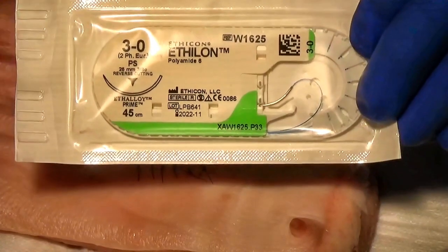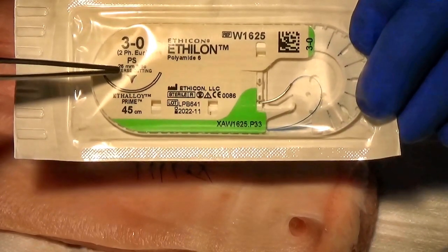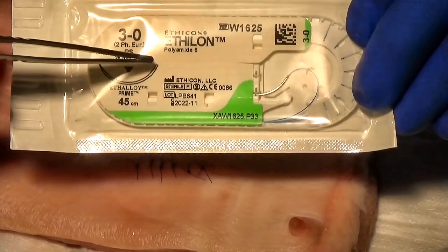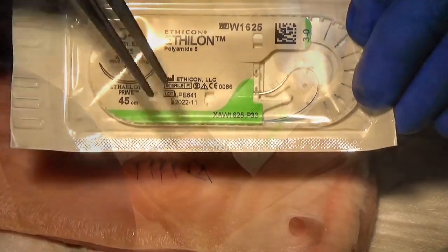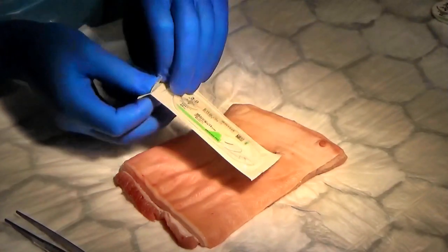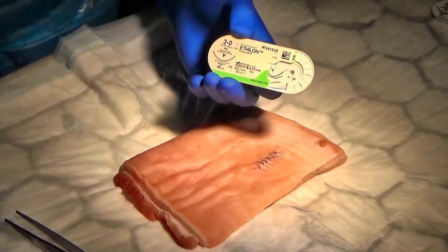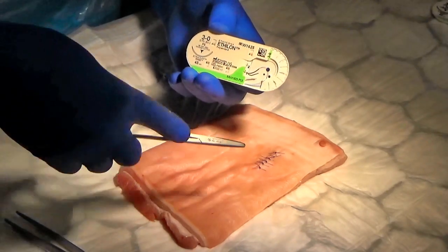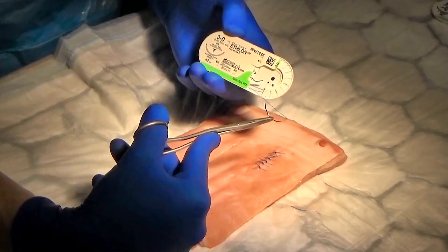If we look at a suture pack, you can see the size of the thread, 3/0. You can see the design of the needle, in this case a reverse cutting needle, and you can see the size of the needle itself, which in this case is 26mm. On opening the pack, you'll be able to get access to the needle, and we're going to take you through how to grasp the needle now. Hold on to the body of the needle about 1/3 of the way along its length with the tip of the needle holders.